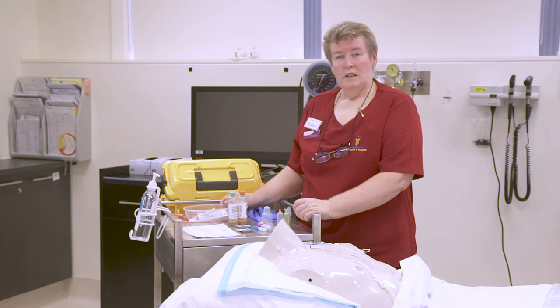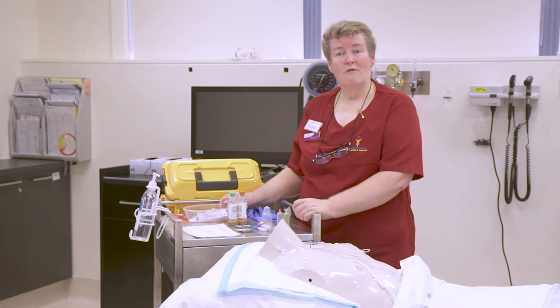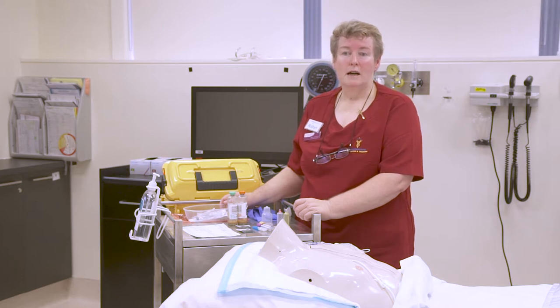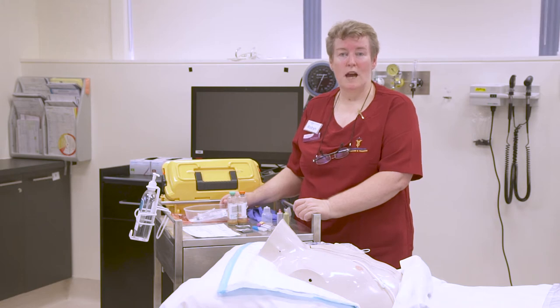So of course I need to identify my patient, go to the bedside, introduce myself, and seek their permission to perform the procedure. And of course we need to use a minimum of 3 patient identifiers to ensure that we have the right patient.